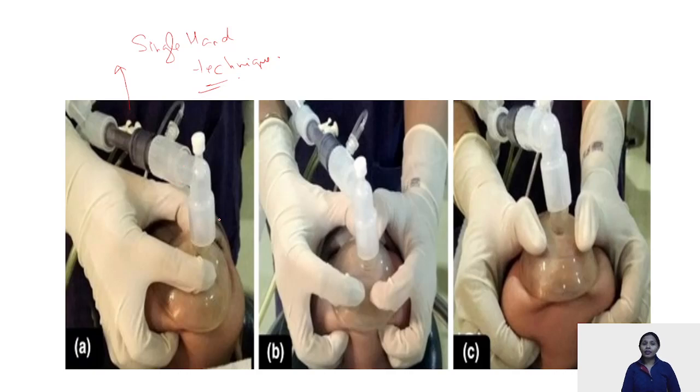Via this head tilt and chin lift, we can make a seal of this face mask with a C and an E. This is the C and E technique, a single hand technique, in which C is used to make the seal and E is used to lift the chin. This is the E which is used to lift the chin.